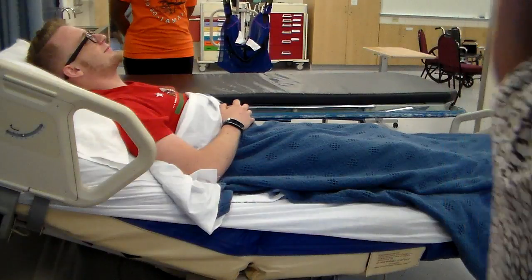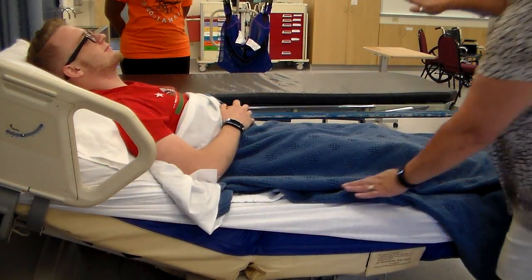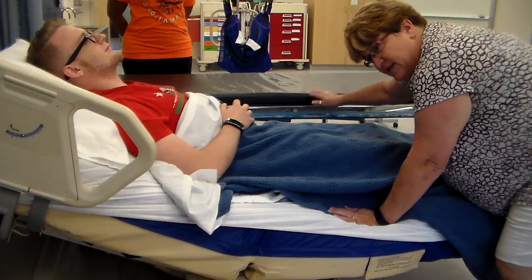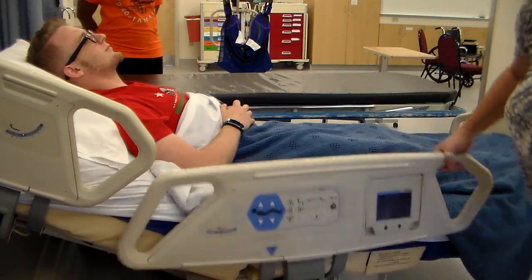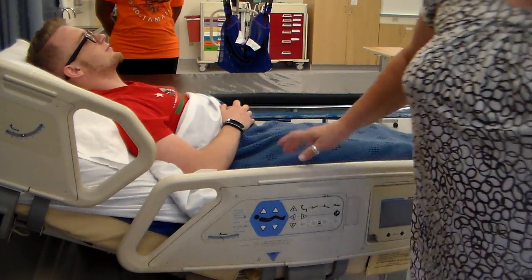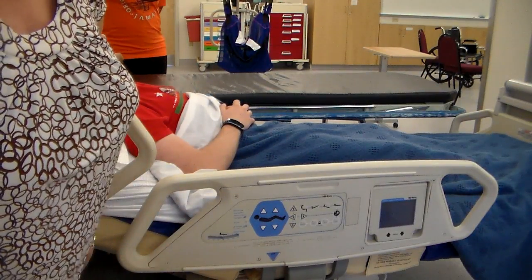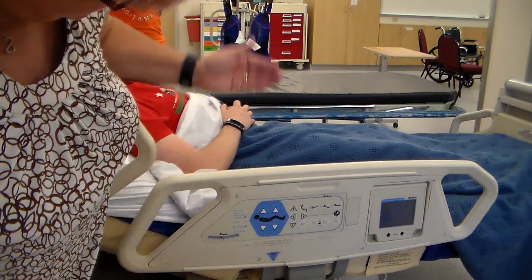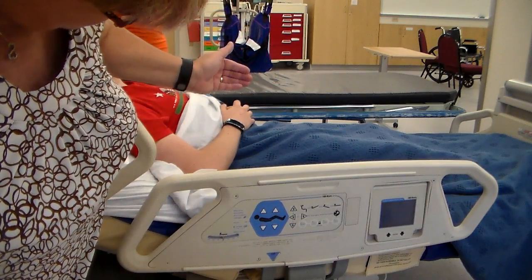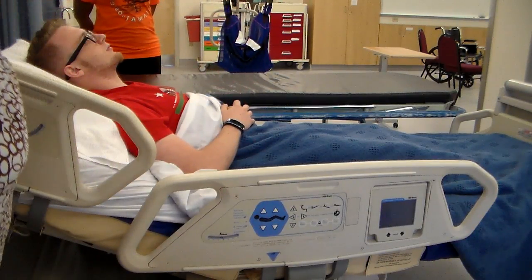All right, so what we're going to do is, first of all, as you can see, there's a huge difference between the levels of these two beds. So what you do is you bring the, whoops, that's the wrong one. I got to go to that side. No, that's the right one. Okay, your instructor's going crazy. All right? Okay. So we want to bring the level of the bed up. Hold on just a moment. No, it is this one.